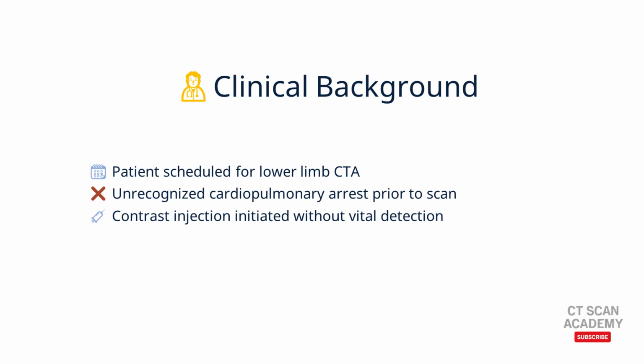Unfortunately, at the time of the scan, the patient was experiencing unrecognized cardiopulmonary arrest. In such situations, contrast injection without prior verification of vital signs can lead to abnormal imaging findings and may carry significant clinical risk.